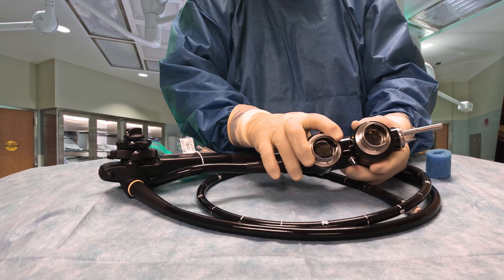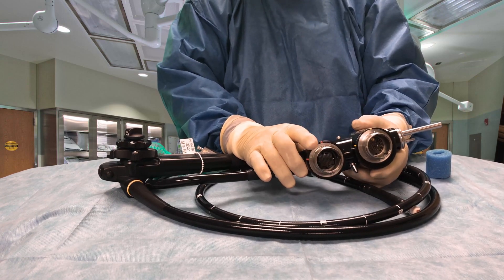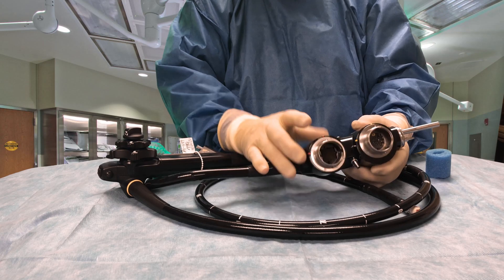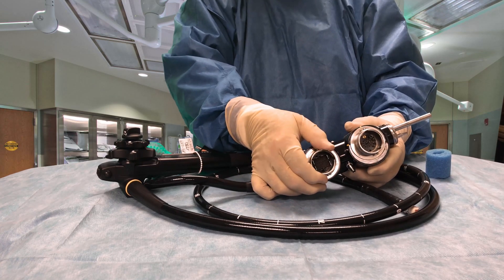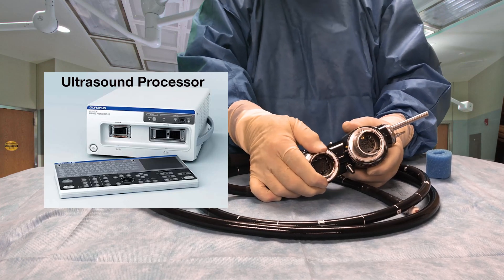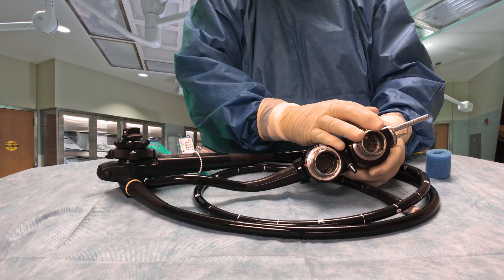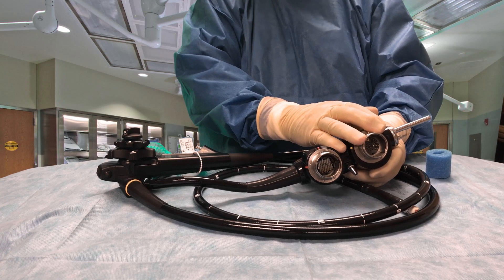This particular electrical connector here is made just for the ultrasound portion of the scope. This will go to an ultrasound processor sitting next to our video processor. The signal from here will go to our video processor to produce a video image on the monitor.